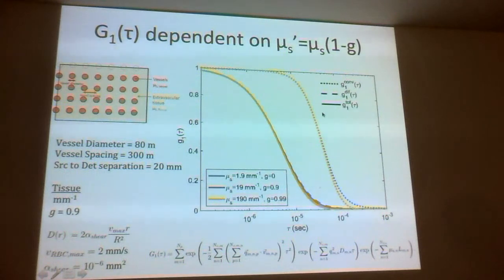Great question, and we can discuss that at length over dinner. I think we need to study that more. But what our simulations have shown, and if Martin will allow me just a few more minutes, is that as you go to that single scattering realm, it's the convective motion that dominates the decay, not the diffusive. That's what it suggests.